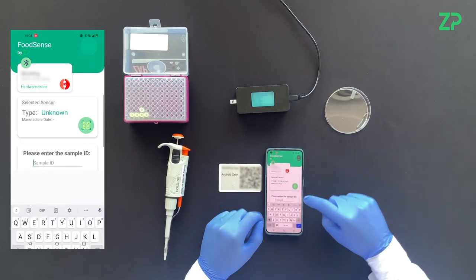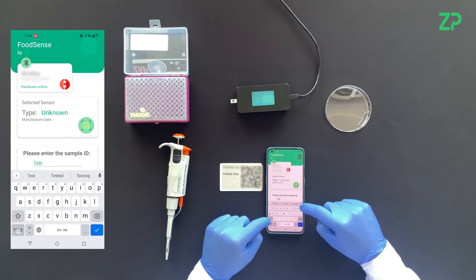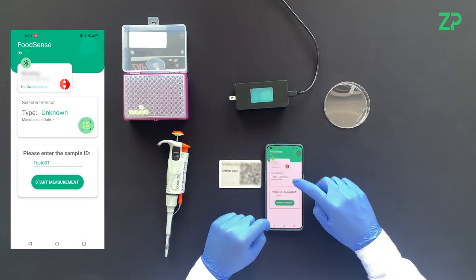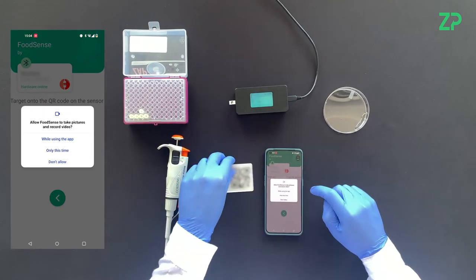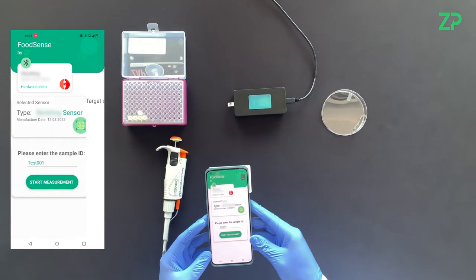A Test ID is then entered to give each test a unique identifier. To gather calibration data, a QR code is scanned for each test.